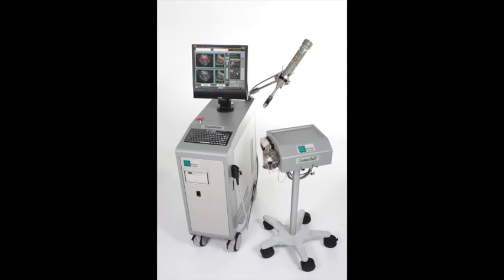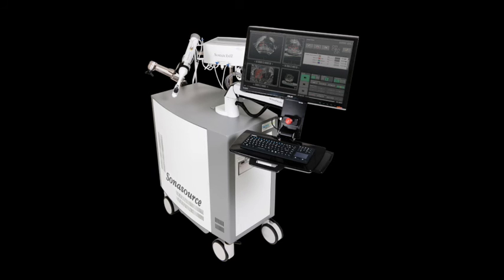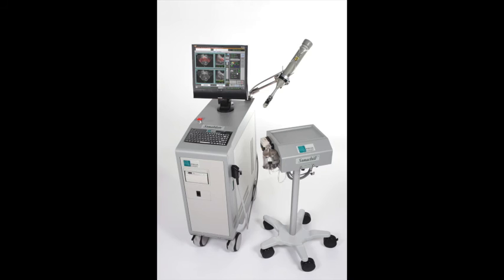And if you're wondering what the device looks like, here is a picture of the device that we have here in Portland. It consists of a console, which is basically a computer that drives the probe, and it also has a chiller that chills the rectal wall when we're heating the prostate to help prevent damage to the rectal wall.